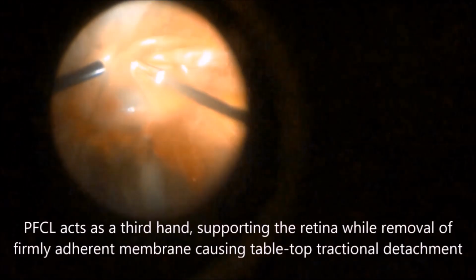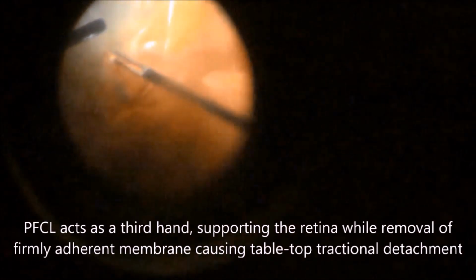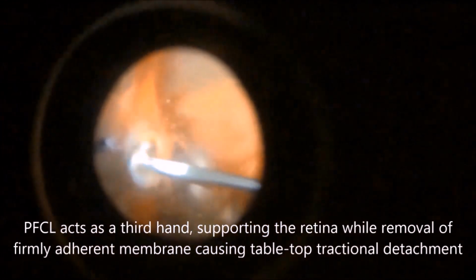In the third video, a tabletop traction retinal detachment can be seen. There was a very thick membrane which was firmly adherent to the underlying retina. Removal of this membrane could have created a break. So PFCL was injected and the membrane was gently removed under PFCL.